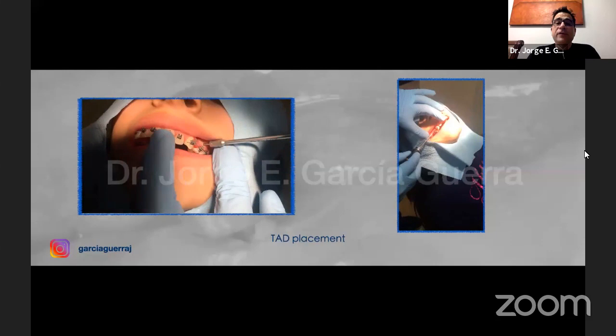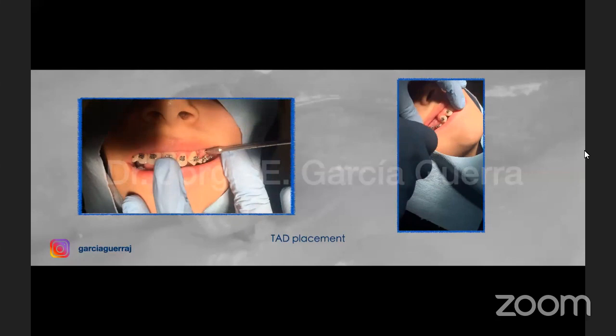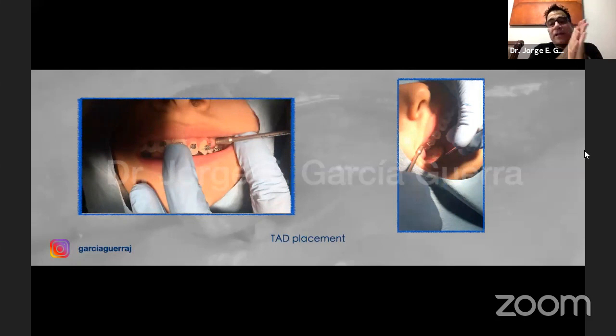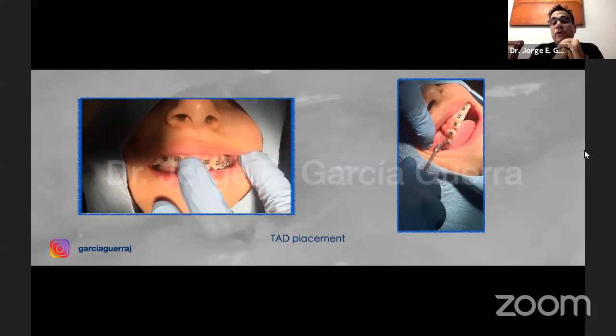It's a little video, so it's very easy to put them. I always like to put some anesthesia. There's a lot of authors, a lot of lectures that say that you could only use topical anesthesia. Personally, I don't want my patients to have any pain. So I always put some anesthesia. Now these mini implants are 1.5 diameter by 8 millimeters long. So it's very easy to put them in the mouth. And it's a very simple procedure.